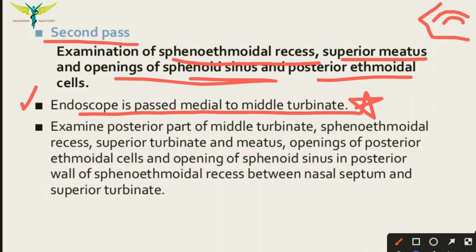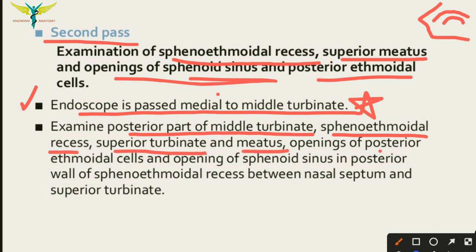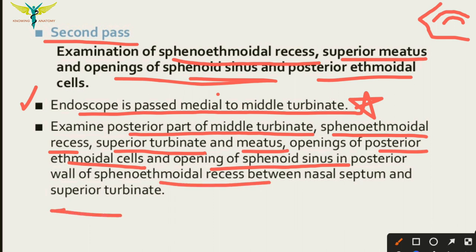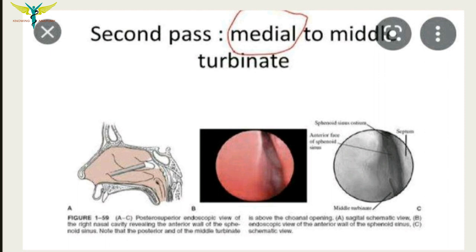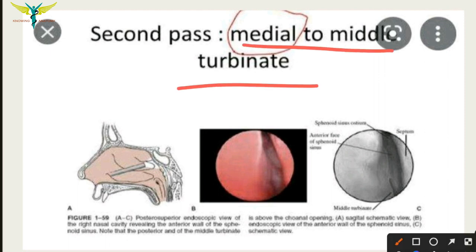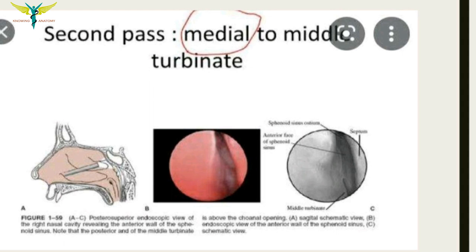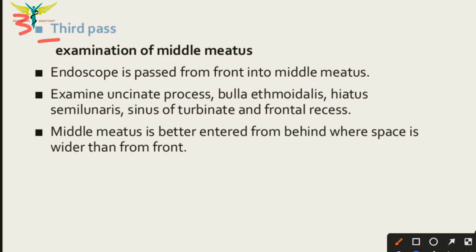In the second pass, the endoscope is passed medial to the middle turbinate — this is the important point to remember. We examine the posterior part of the middle turbinate, the sphenoethmoidal recess, superior turbinate, superior meatus, openings of the posterior ethmoidal cells, and openings of the sphenoid sinus in the sphenoethmoidal recess. Now coming to the third pass.